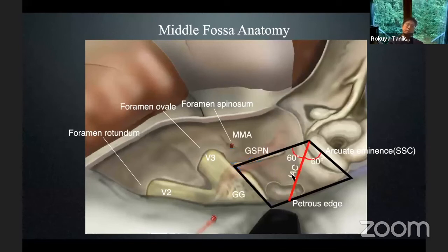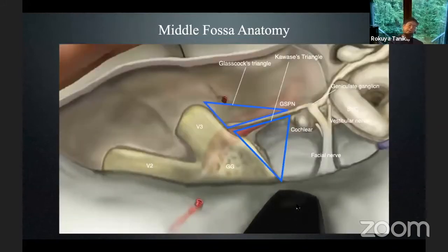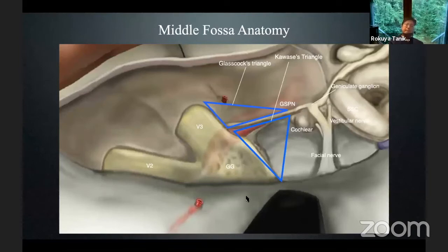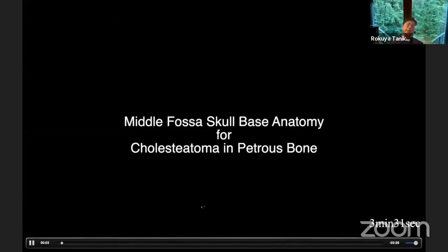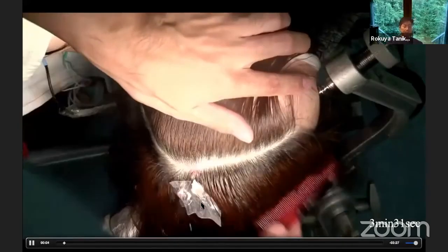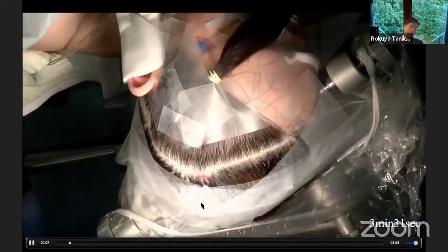During the temporal rhomboid drilling, exposing the internal auditory canal, we can recognize this anatomy — very important in anterior petrosectomy and the temporal rhomboid approach. We can secure the operative field between V3 and the 7-8 complex. In the middle fossa skull base anatomy, this following is not a tumor case, but a good example to understand the middle fossa anatomy: a left-side frontotemporal parietal deep craniotomy to address a cholesteatoma in the middle ear.